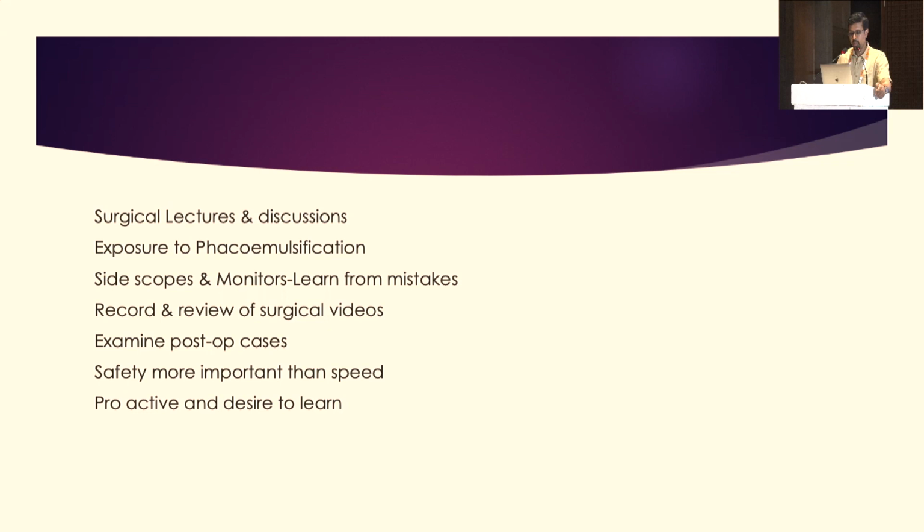There is exposure to phacoemulsification. We have side scopes and monitors so that they can learn from their mistakes. Their surgeries and steps are recorded and reviewed. Examination of post-op cases is encouraged so that they could learn better. They should understand that safety is more important than speed. Finally, they should be proactive and there should be a desire to learn.